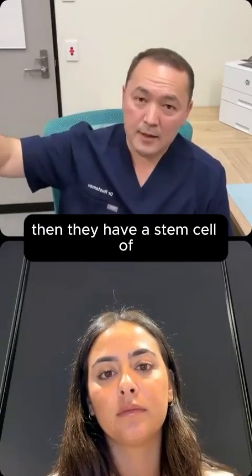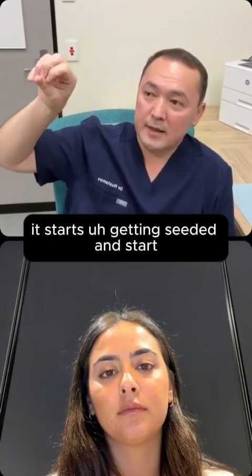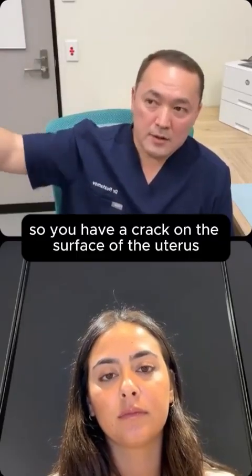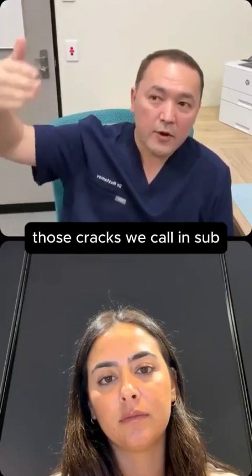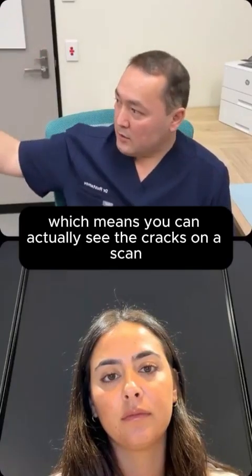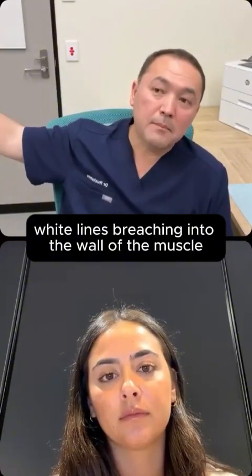Then the stem cells of the basal endometrium start getting seeded, and every time you have a period, you start bleeding in the wall. So you have a crack on the surface of the uterus. When you do a scan, you can see those cracks. We call them subendometrial lines, which means you can actually see the cracks on a scan, white lines breaching into the wall of the muscle.